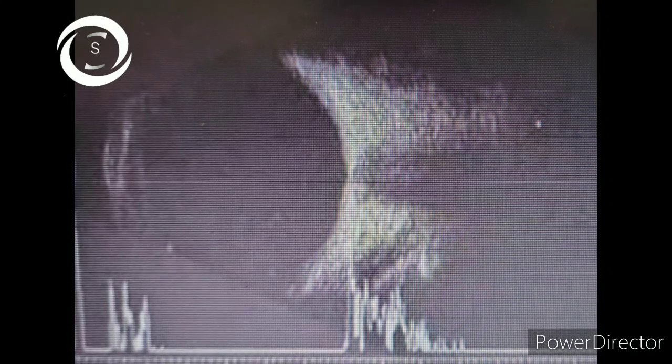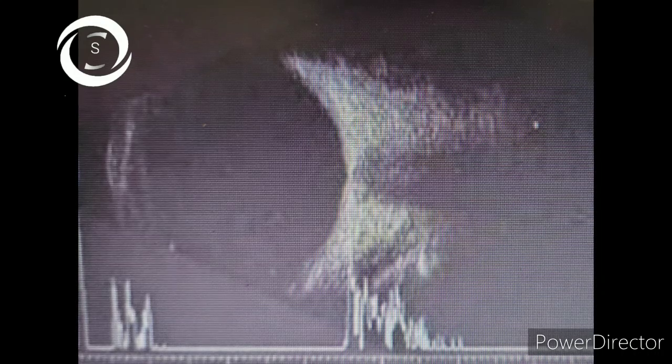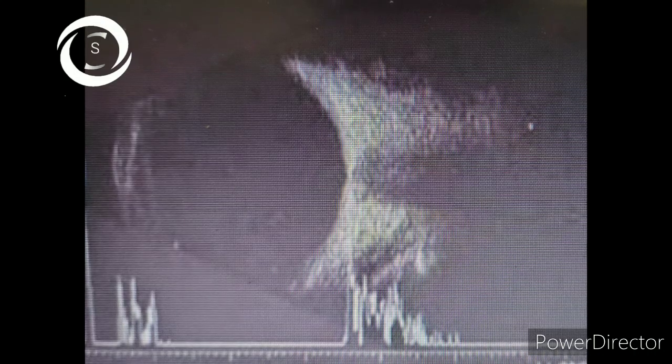Here you can see the normal B scan, and you can also see along with the A scan spikes — sometimes the A scan will be displayed and sometimes not. You will say that this is a B scan printout of the eye showing hypoechoic normal vitreous; retina, choroid, and sclera are hyperechoic and looking normal. I can appreciate the optic disc and optic nerve as well, and this is a normal B scan of the eye.